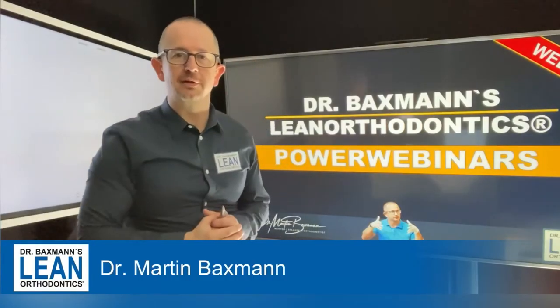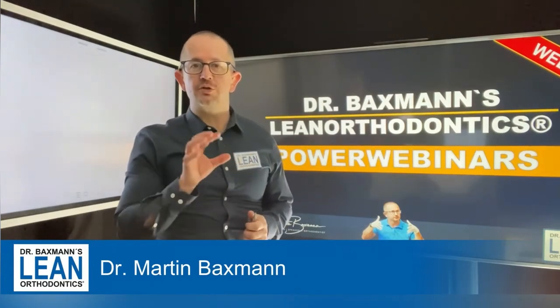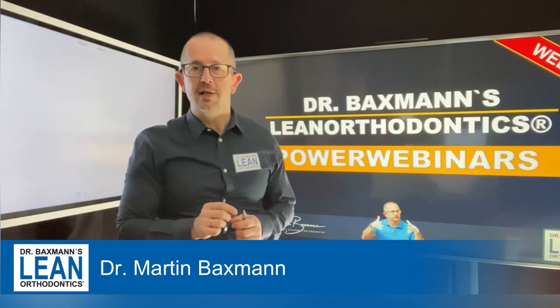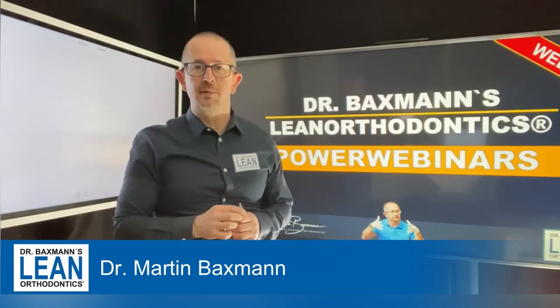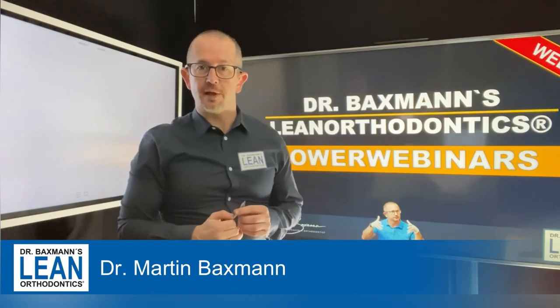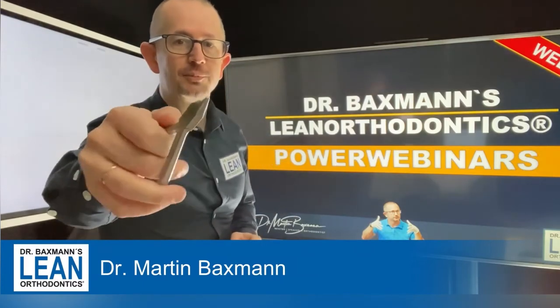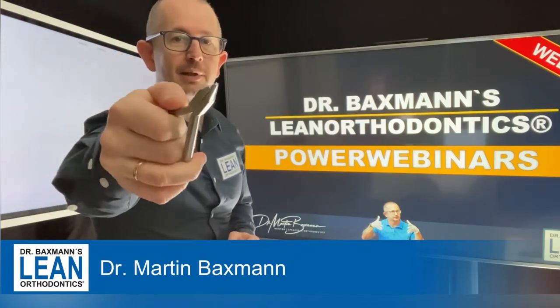Welcome to my power webinars in lean orthodontics. My name is Dr. Martin Baxmann. Today we are going to do some wire bending for our 7 that is rotated and needs some space closure as well. What you are going to need for that today is an 018 stainless steel wire and this plier is a loop bending plier.